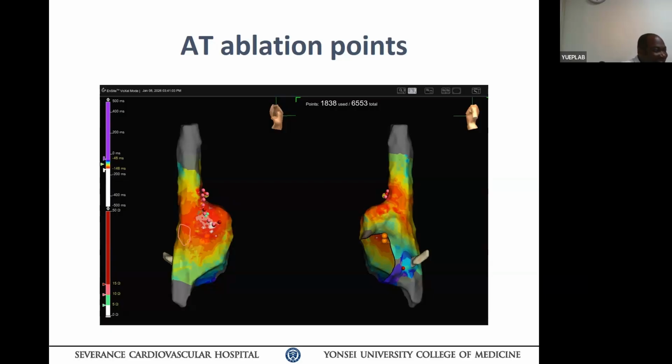And also the phrenic nerve. Yes, that's why there are so many precautions. It is this important. When you're messing around that area, you get a sinus node activation map first before you think of ablating, because you can cause sick sinus syndrome in these young patients. So you really need to put in a baseline map of the sinus node and identify where the sinus node pacemaking activity is. The sinus map has to be done carefully. You want to do it with isoproterenol infusion. You don't want to do it without it.